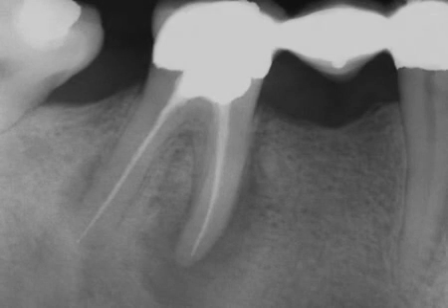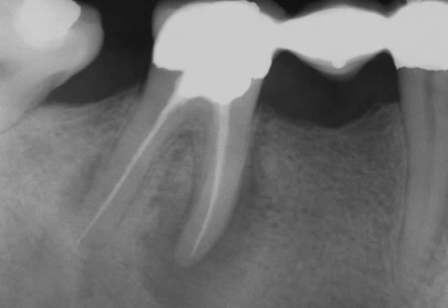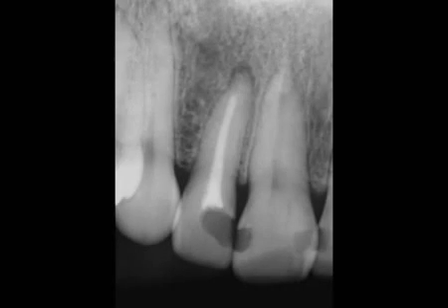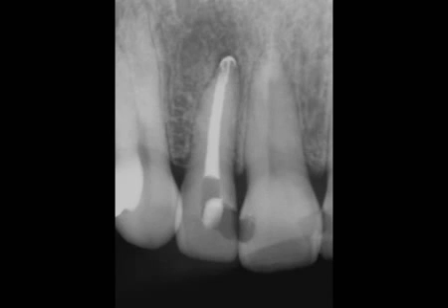In this preoperative radiograph, note the mesial root is ledged and the carrier isn't tracking the canal. Manual ProTaper files can completely eliminate this type 1 ledge, making cone fit and packing predictable. Notice the postoperative anatomy. Here is a maxillary lateral incisor with a large type 2 ledge. In this instance, I would risk perforation if I tried to completely eliminate this defect. The post-treatment film demonstrates that the ledge has not been eliminated, but importantly, treatment extends to the terminus.